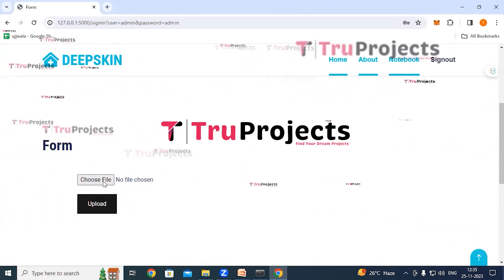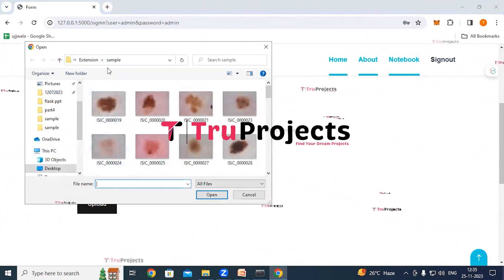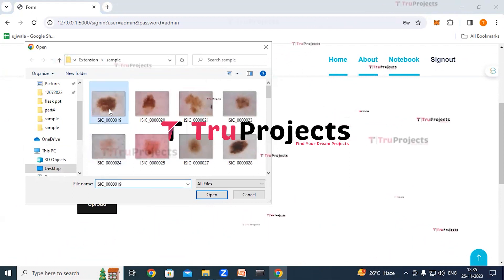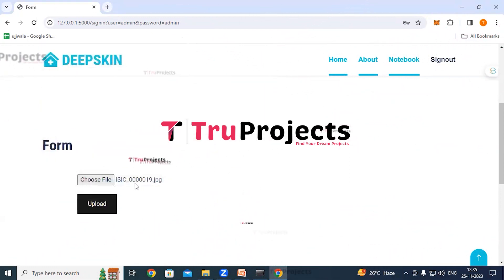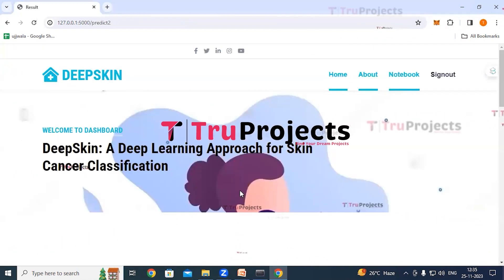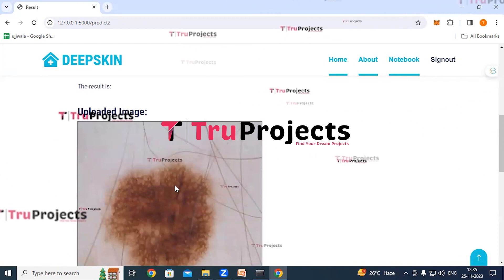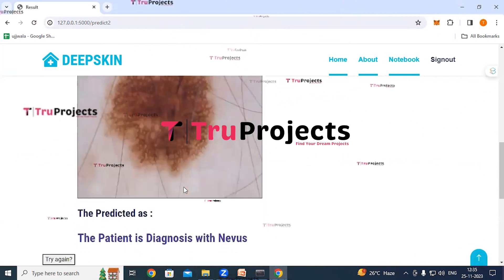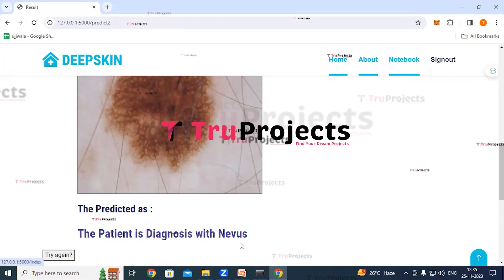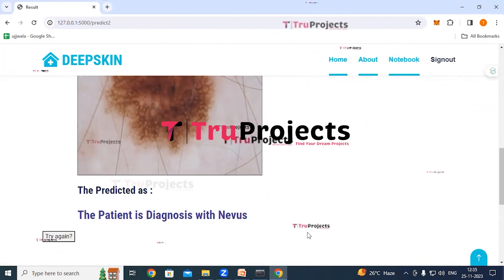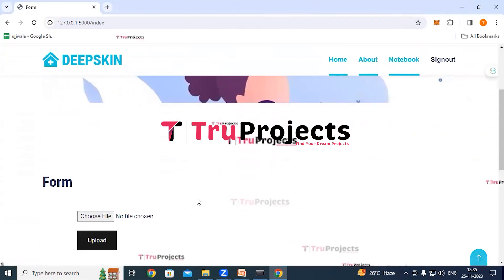On the skin cancer classification page, upload a skin disease image by clicking the 'Choose File' button, selecting an image from the sample images folder, then clicking Upload. The system displays the uploaded image and provides a prediction. For the first test image, the patient is diagnosed with nevi. Click 'Try Again' to test another image.